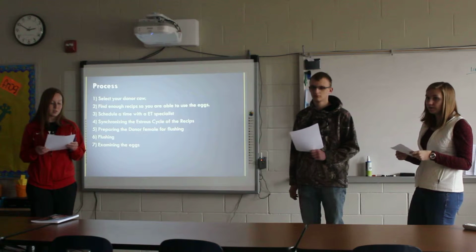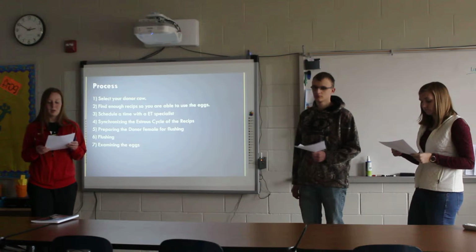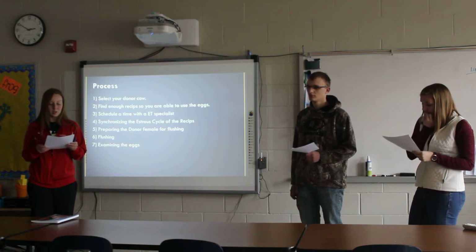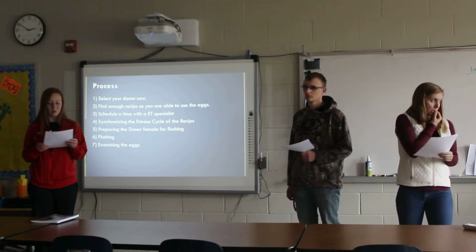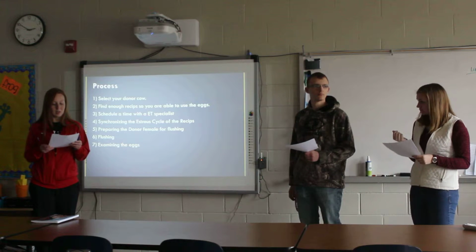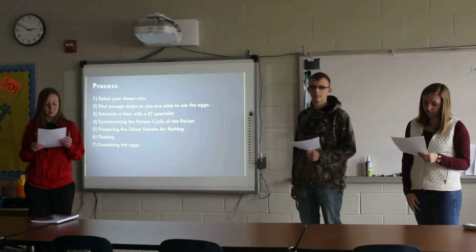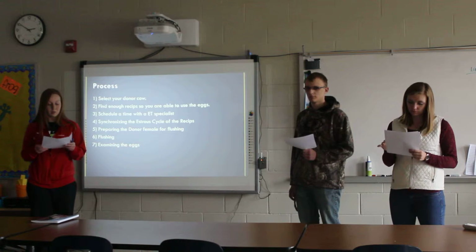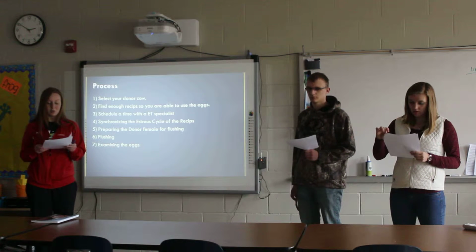Once the catheter is in place, the balloon is inflated by pumping saline into the balloon. Then you take out the embryos by flushing the uterine horn. It's filled with flush media and then massaged to allow the embryos to flow out of the tract. This process is repeated several times in each uterine horn.